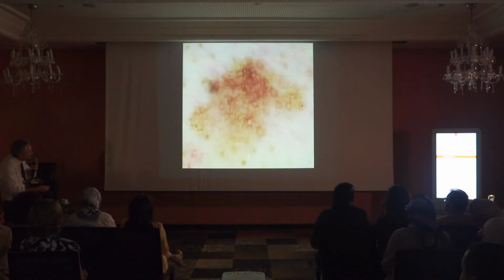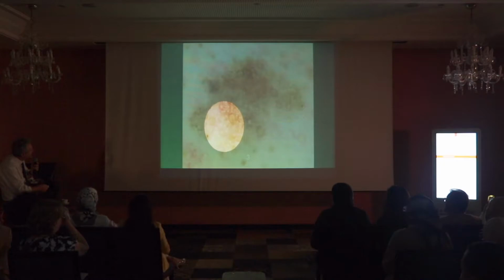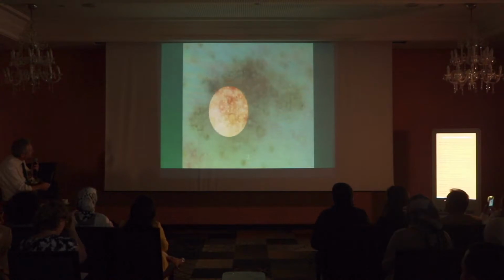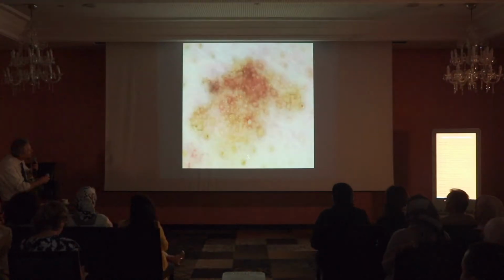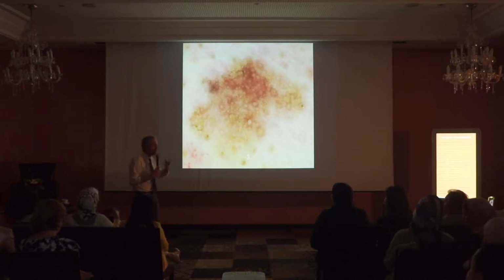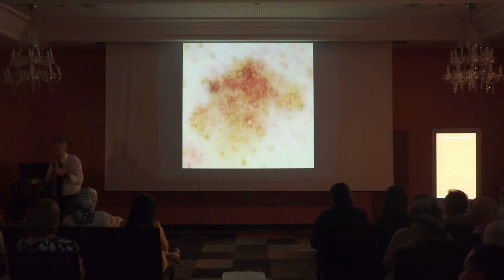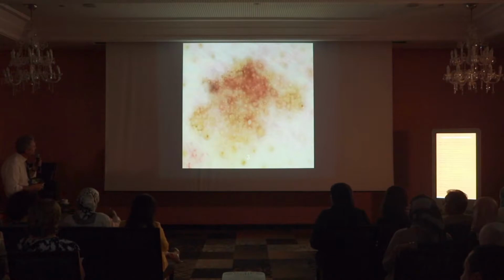Well, I don't really see the parallel lines here. I mean, you say these ones, for example. Yeah, but these are not truly parallel lines, you know. This is like a circle within the circle. Yeah, these are basically circles. So I told you it's not easy on the face. Whenever we are not sure that we are looking at benign features, we have to stop.